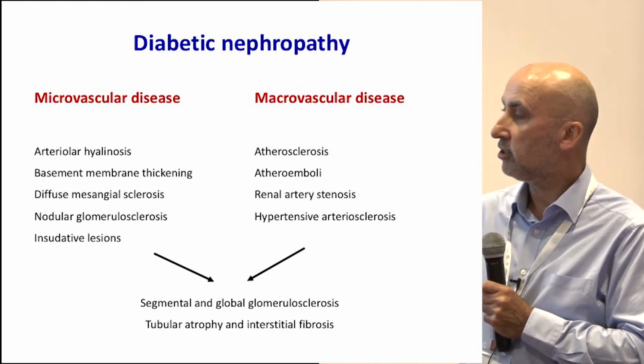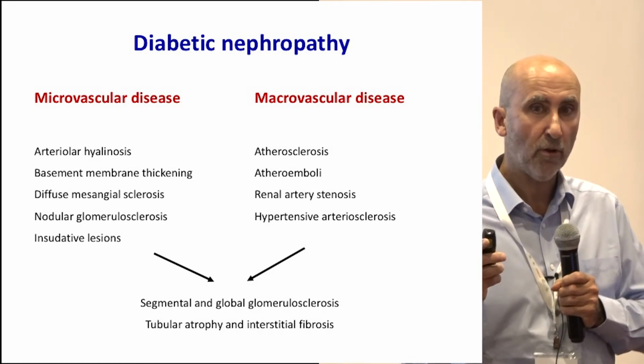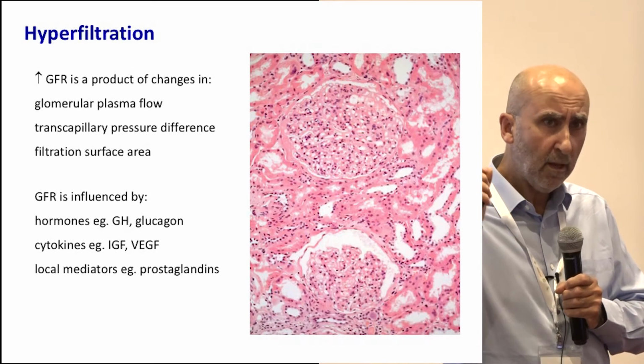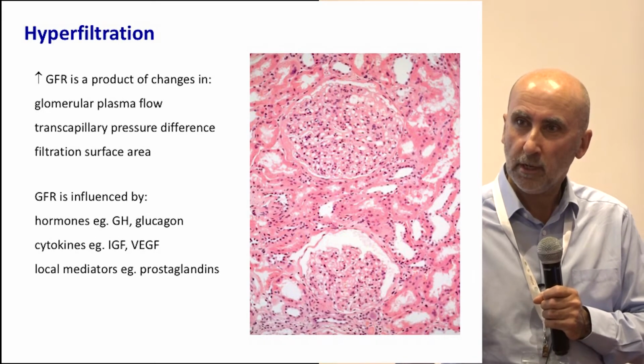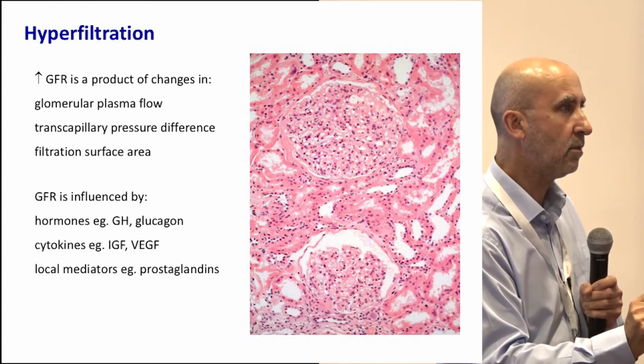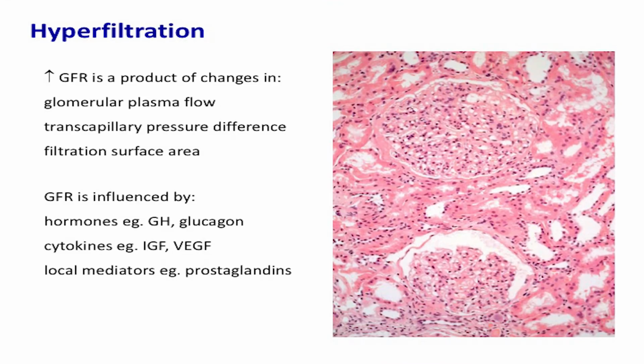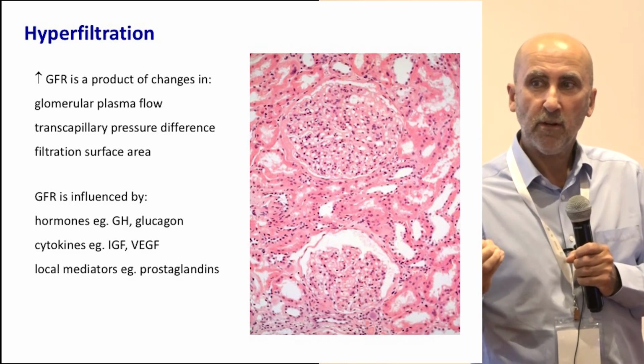And when you get down to this stage, at the bottom of advanced atrophy and fibrosis, often the changes are rather non-specific. The earliest changes that your diabetic patients will suffer in their kidneys are clinically silent, and that's the stage of hypertrophy. I'm very familiar with diabetic kidneys in my autopsy work, and they are big. They're usually about 50% bigger than the average person's kidneys. And this also applies to the glomeruli. That is a huge glomerulus.